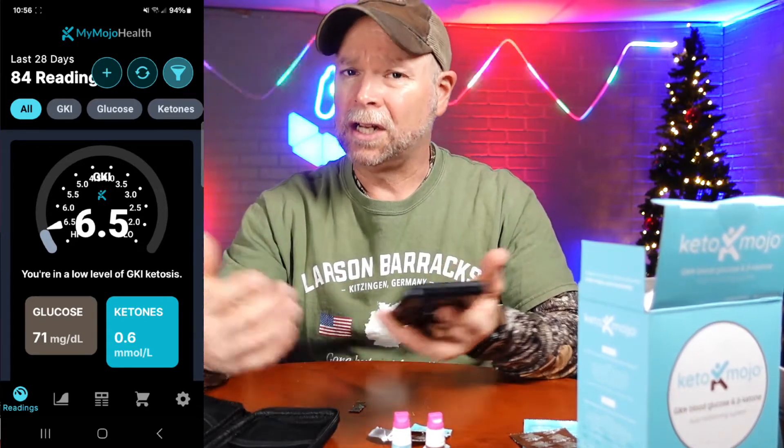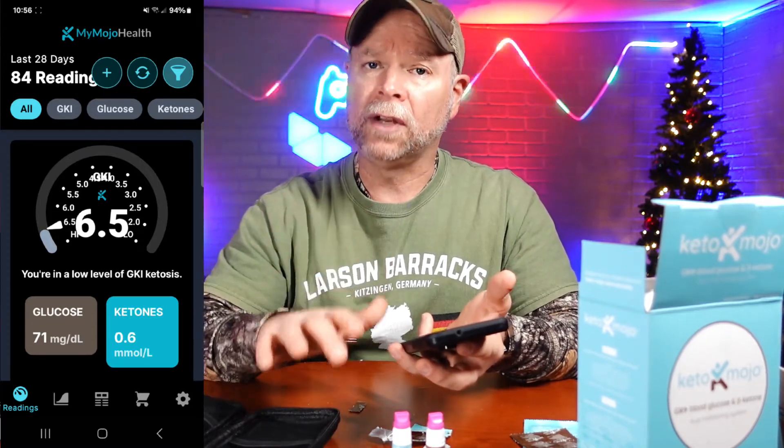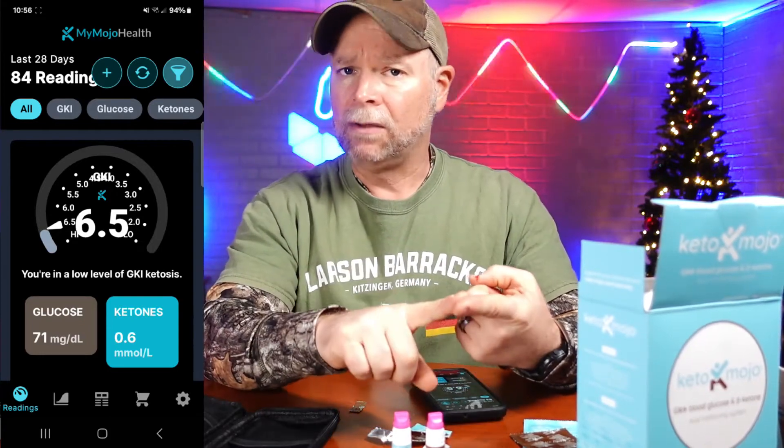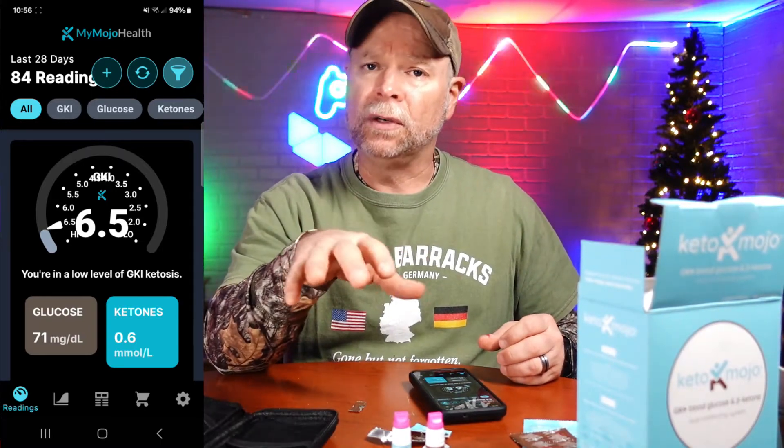Your ketones and your glucose are going to change on a regular basis, just like your blood pressure changes whether you stand up, sit down, exercise, or walk — it's going to affect your ketones. My suggestion is that you check at the same time every day and do at least three days in a row. You might check first thing in the morning — keep in mind your body is waking up, so your glucose will often be elevated. That's your fasted state. You might also try two hours after a meal, or one, two, and three hours after waking up to see how your body functions.